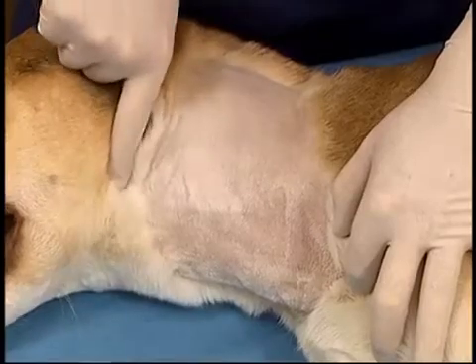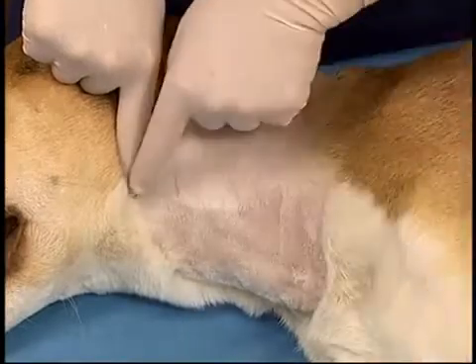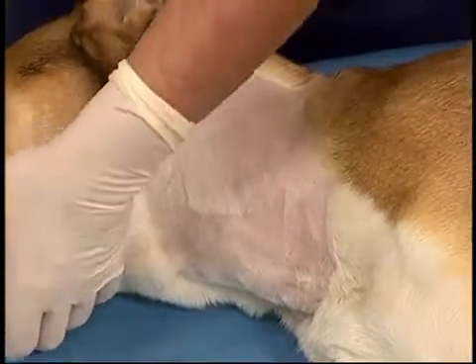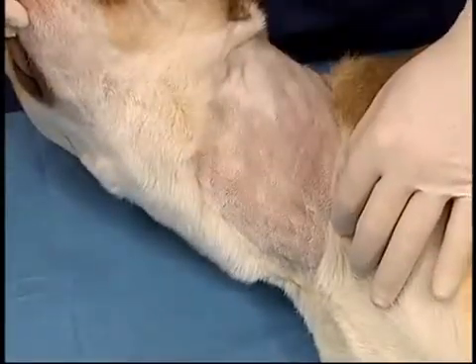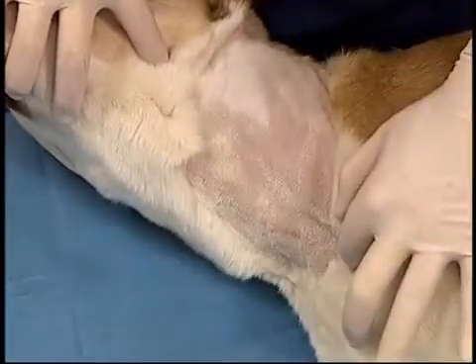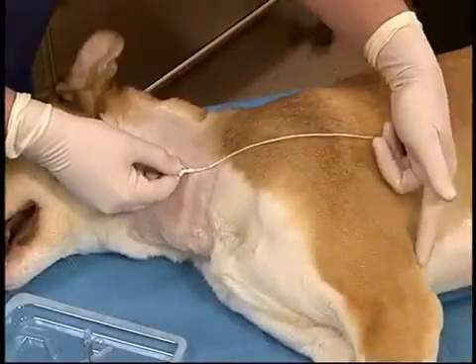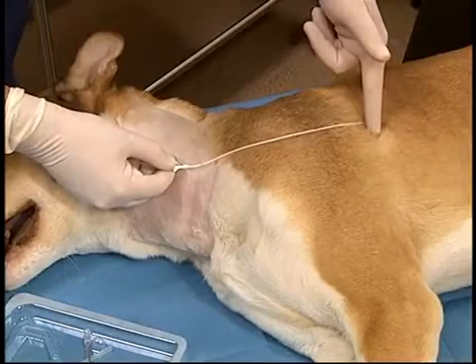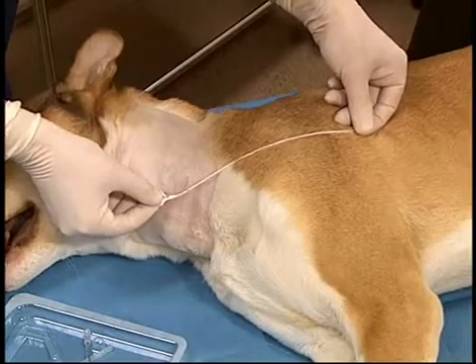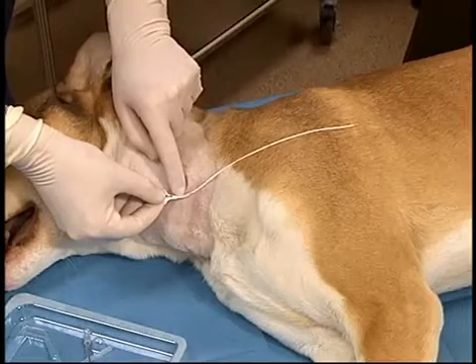The jugular vein runs from the angle of the mandible to the thoracic inlet in a straight line. This location is maintained no matter what position the animal's head is in. The catheter is pre-measured to an appropriate length, which is approximately the fourth intercostal space when using the jugular vein, in order that central venous pressure measurement can be done. An imaginary line is drawn from the caudal aspect of the elbow with the limb in a neutral position up to a level that is in line with the venotomy site.